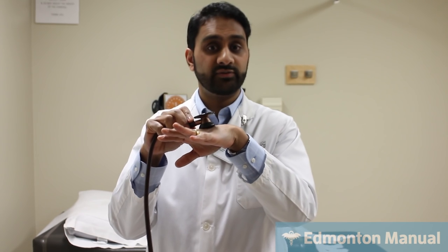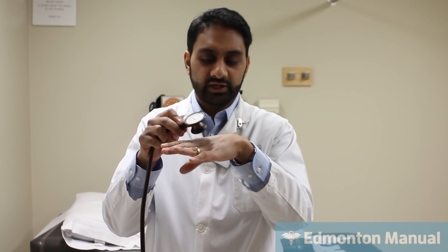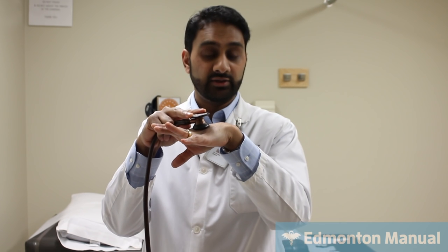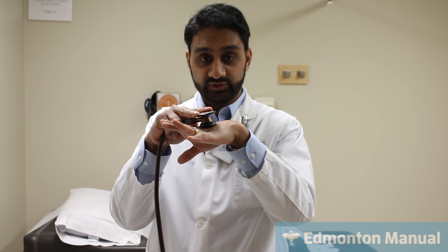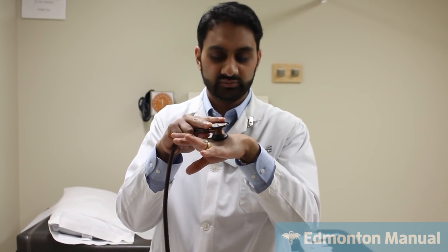One of the things you can do is, if you're listening to something with the bell and you start to wonder whether it is, let's say, a split S2 versus an S3: if it's an S3, you should hear it best with the light pressure. What you can then do is push down harder with the bell side, and stretching the skin actually makes it act like a diaphragm and attenuate the low frequency sound. So if you push hard with the bell and the sound gets softer, that reassures you that it was a low frequency sound. Versus if it got louder, then it makes you wonder, maybe that's a split S2. So those are the two options you can use with the Littmann stethoscope.